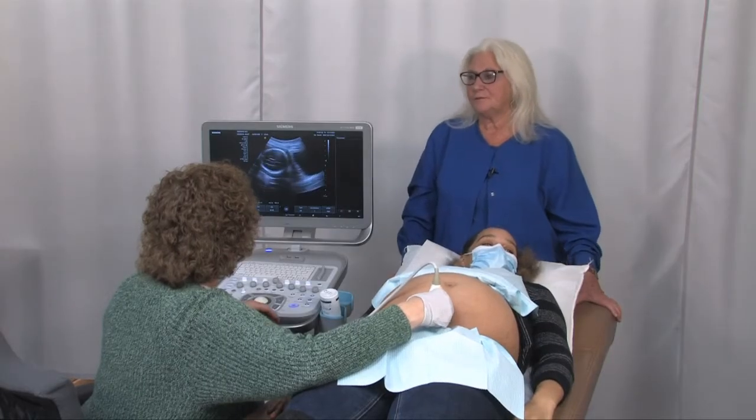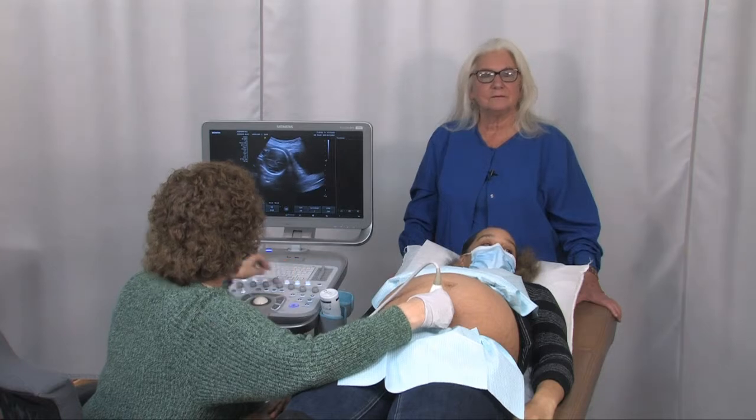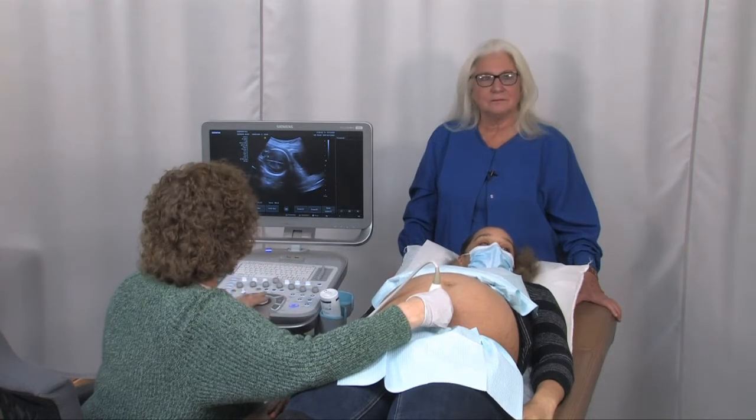Okay, so I'm going to start out here just midline sagittal. I have the nice full bladder. Let me know if you need to use the restroom while we're doing the scan.